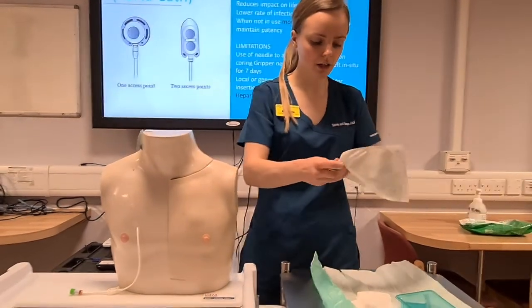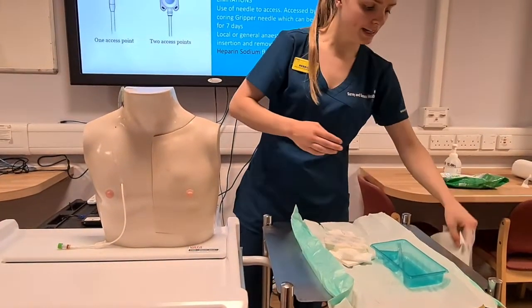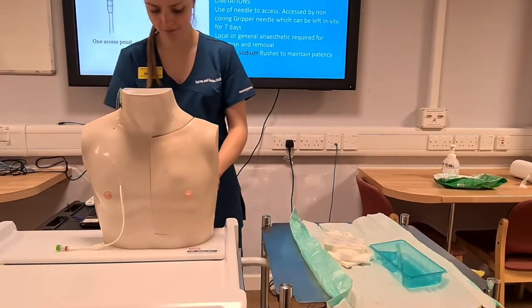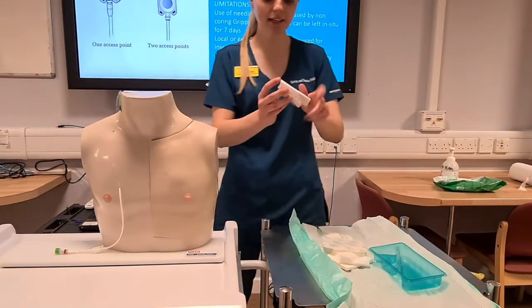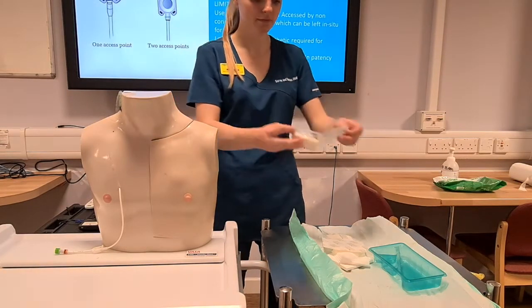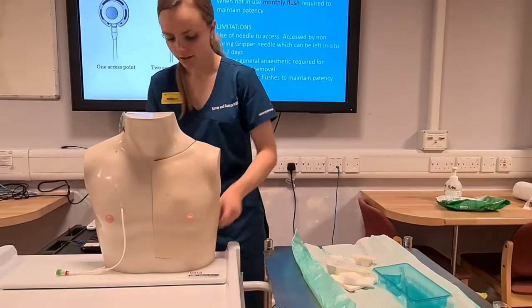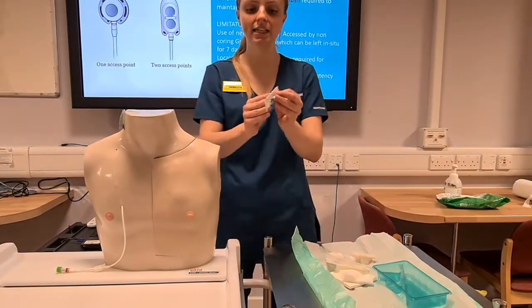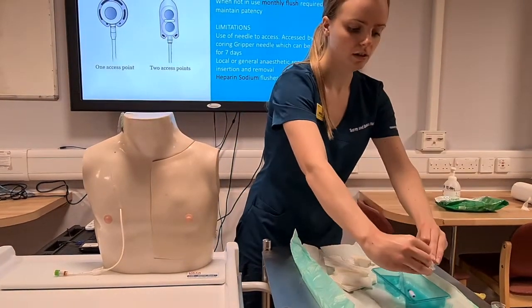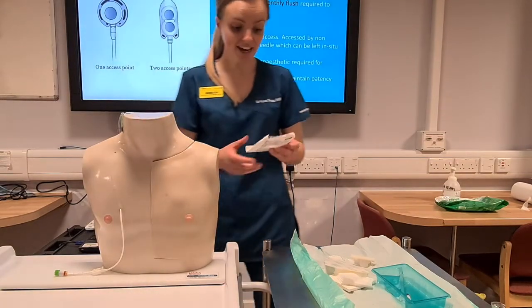So I'm going to open this up so that this is using surgical ANTT, making sure that my outside packaging does not touch my sterile field. Chloraprep, cleaning with chlorhexidine, asking your patient for any allergies. Bionector, all lines need to have a Bionector at the bottom of it or a bung on, so that you are protected for air embolism and infection.